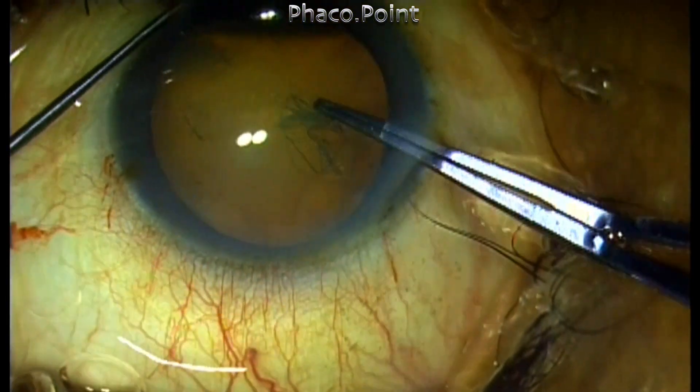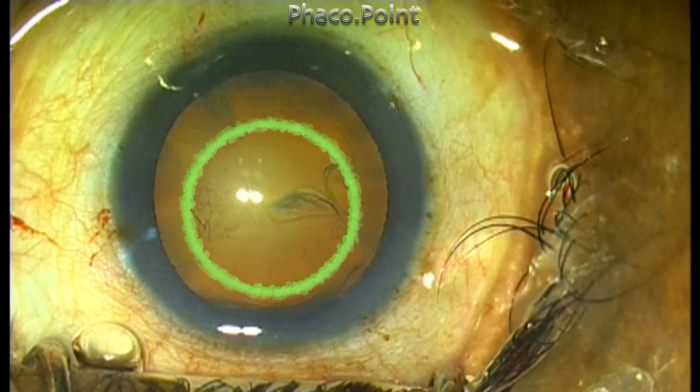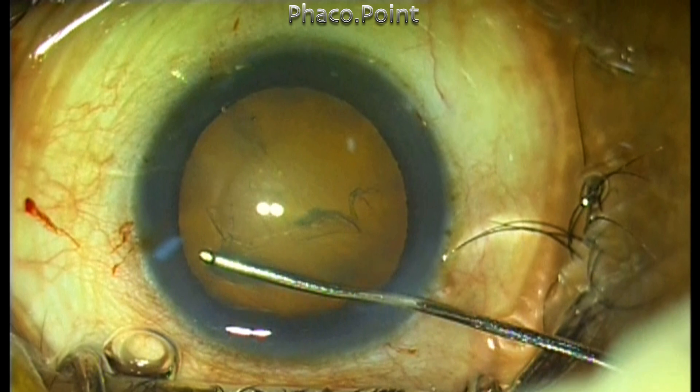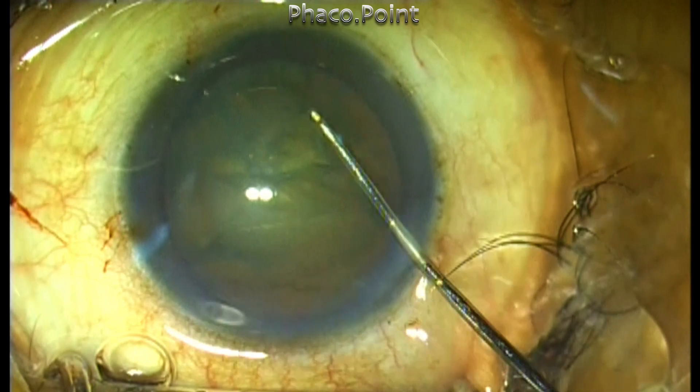Let me show you a case where the rhexis ended up being slightly smaller — about 5 millimeters or less. Since this was a grade 2 nucleosclerotic cataract, I decided to go ahead and complete the phacoemulsification. The hydrodissection was proper and I was able to get good cortical cleavage hydrodissection.